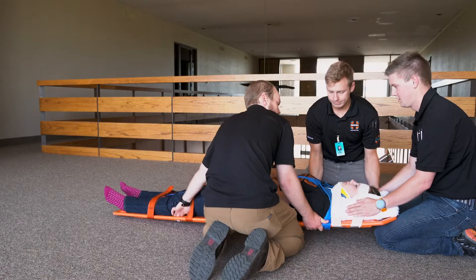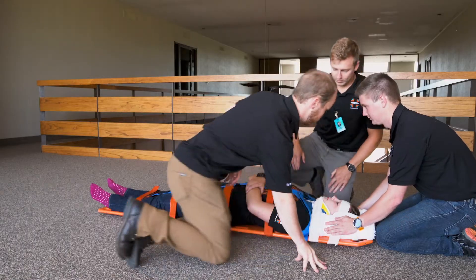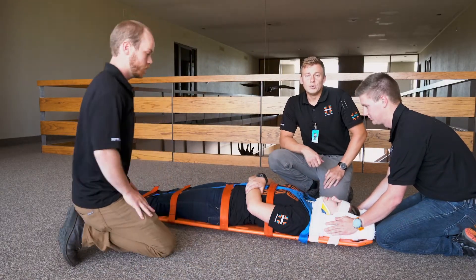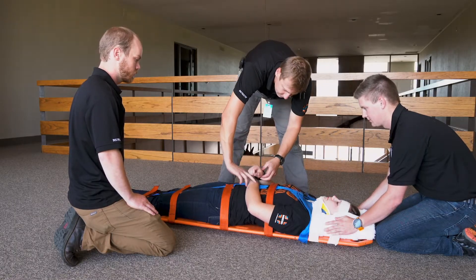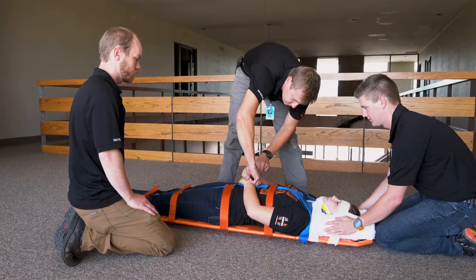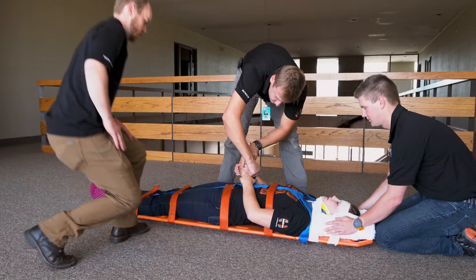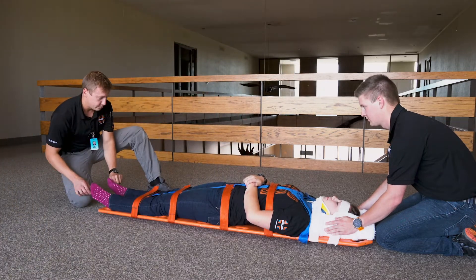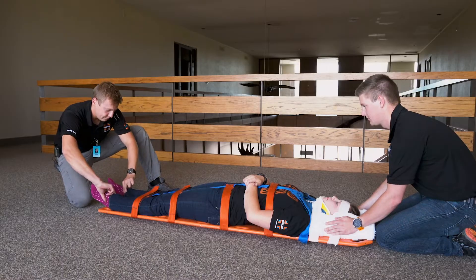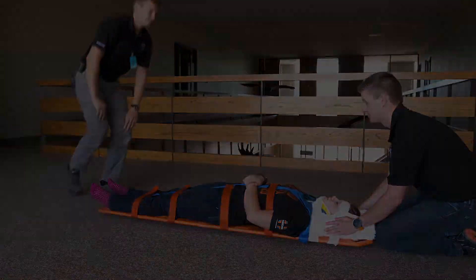Back down on your count — one, two, three. Finally, we'll reassess the patient's distal CSMs. Squeeze both my hands. What finger am I touching? Index. What finger? What toe? Wiggle your toes for me. Great.